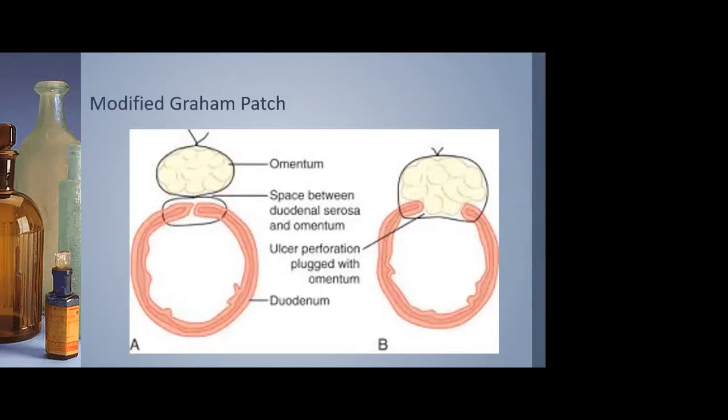But then you're tying laparoscopically with long tails, which is its own kind of pain. Yeah. The last one, it'd be very difficult to do with the endo stitch. I was going to say, just given the fact you have a straight needle is difficult. But yeah, the last one we did was laparoscopic with the curved SH needles. And yeah, it was a little painful trying to manage the tails, because they all want to get intertwined, especially when you're intentionally keeping them all long.